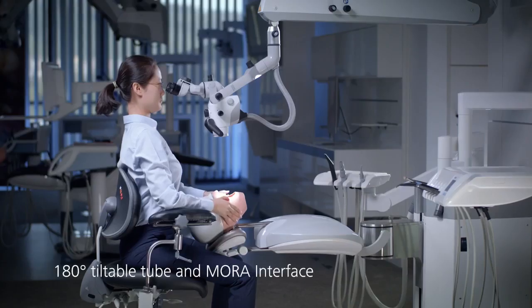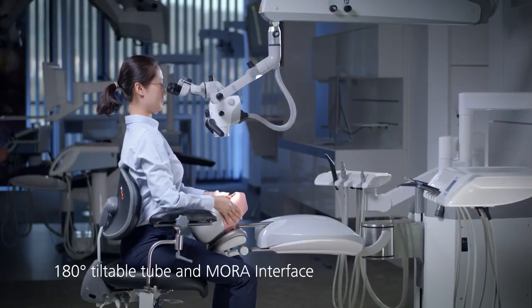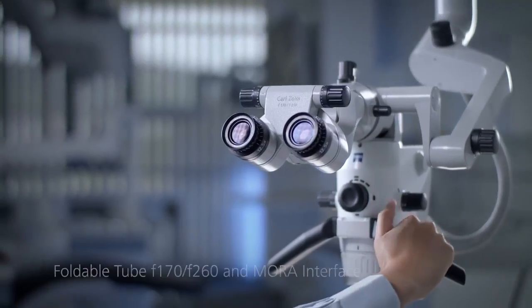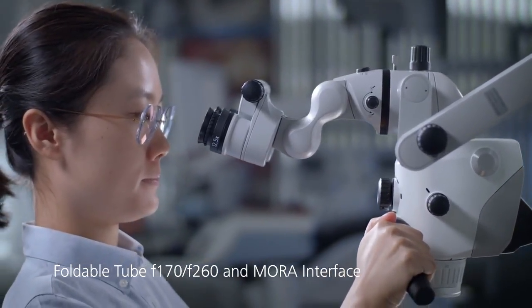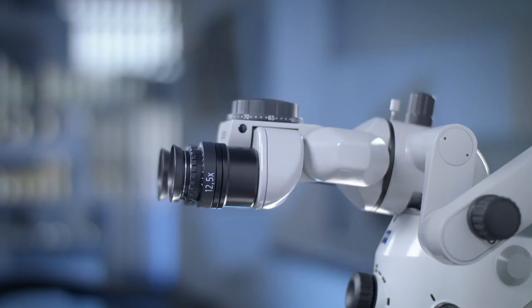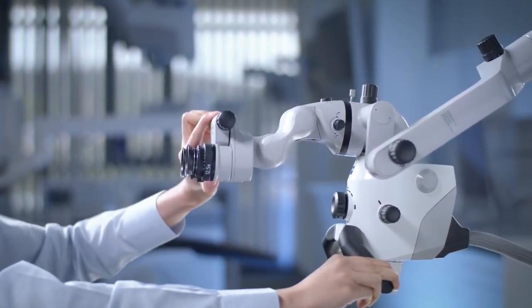The 180 degree tiltable tube and Mora interface enable very good ergonomics and additional distance from the patient. The foldable tube and the Mora interface are a perfect team. Combining them provides maximum ergonomics with high flexibility for a variety of working positions. Compared to the tiltable tube, the foldable tube adds an additional 4 cm in the extended setup.